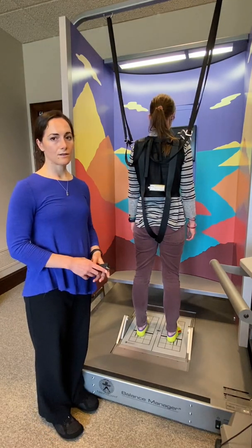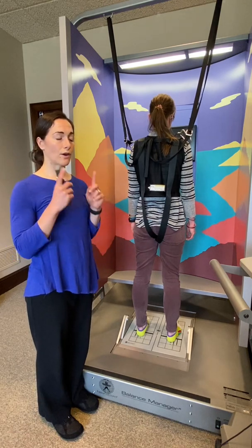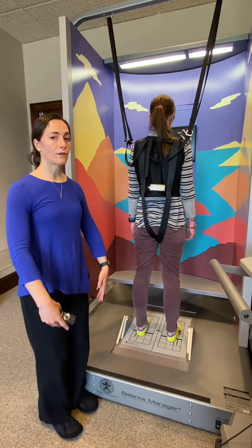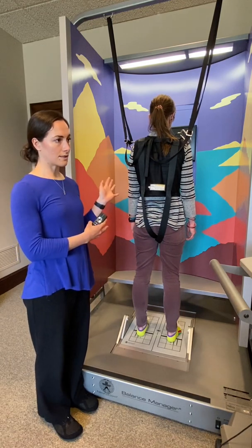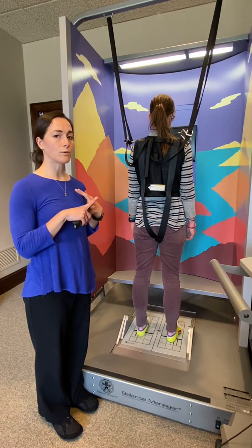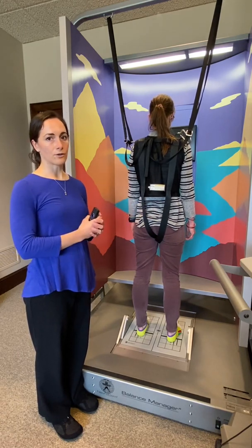The purpose of this test is to assess the function of all three of our balance systems. We use our eyes for balance, our inner ears for balance, and the feeling in our feet and legs to tell us where we are in space and how we're moving in space. Once we do this test, we can figure out which of those balance systems are working well and which ones may need improvement, and that will guide our treatment sessions.